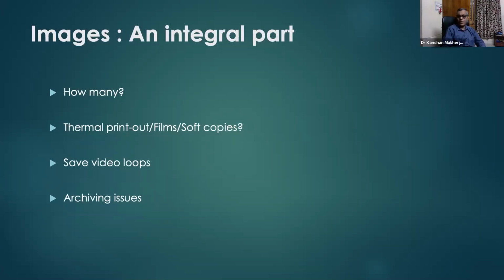Images. They are an integral part of reports. Now the question is, how many images do you include with a report, with a typewritten report or a handwritten report? Well, the answer is, I don't know. There are many things to balance here, cost being the main issue. Whichever you feel appropriate and whatever your employer allows, follow that.